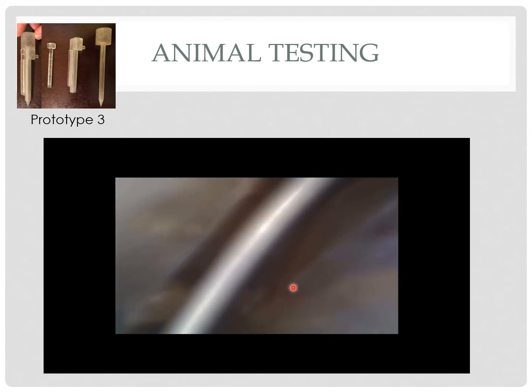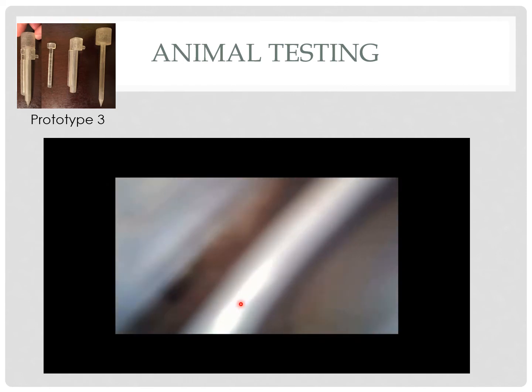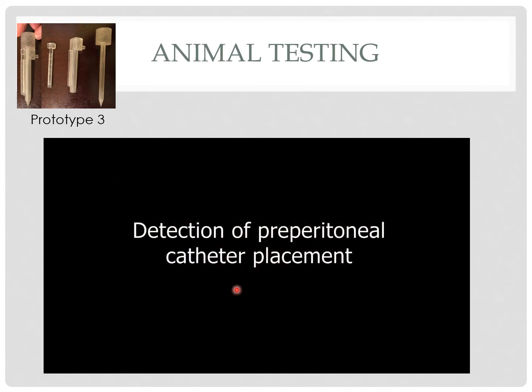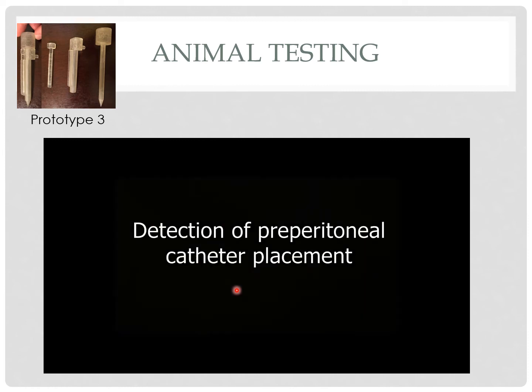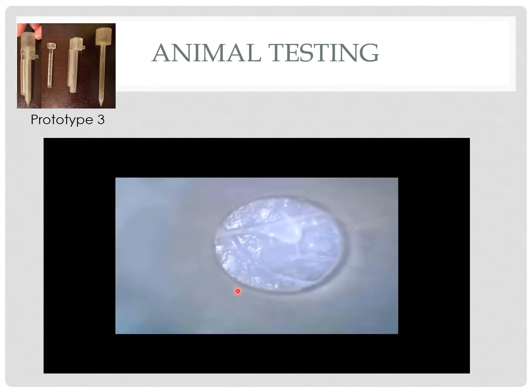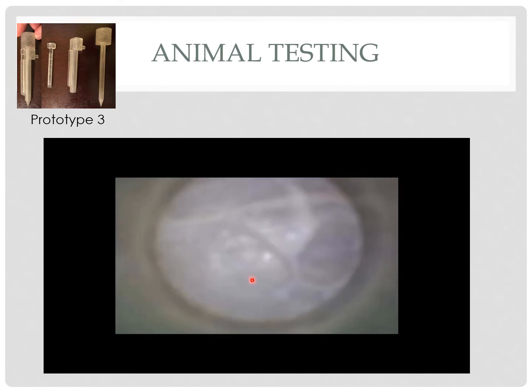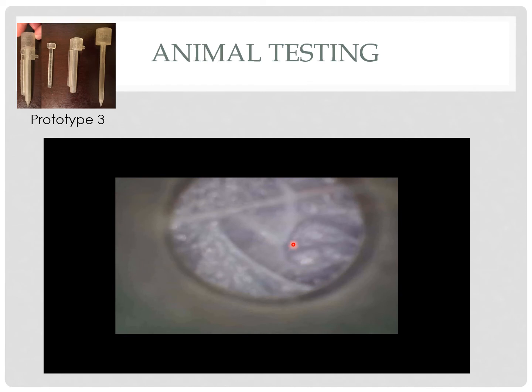We then place the catheter under this direct visualization shown here and could then visualize that it was in proper placement and then removed our device. We also were able to detect faulty placement of the catheter. Basically here is the device where it's shown in a pre-peritoneal or incorrect position, where we could directly visualize it and then halt the procedure and correct the surgical error. So the device showed that we could both identify the proper placement and then prevent us from inadequate placement.